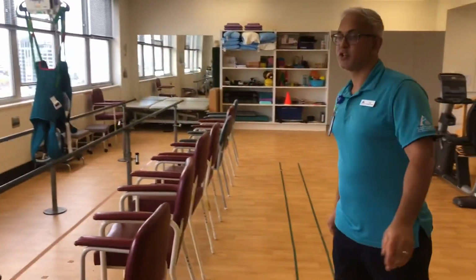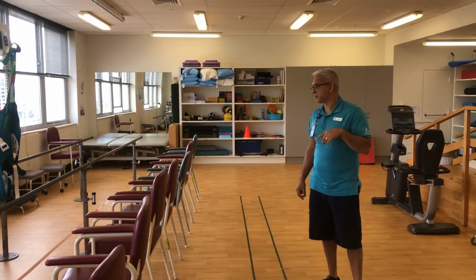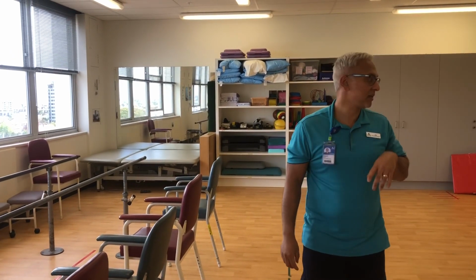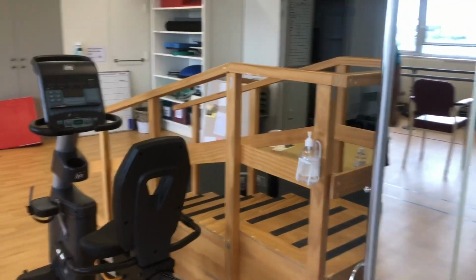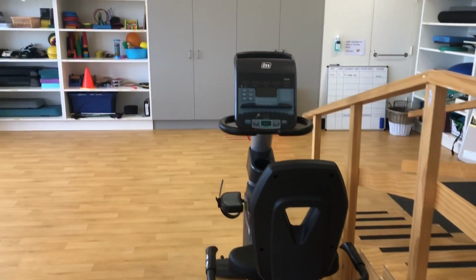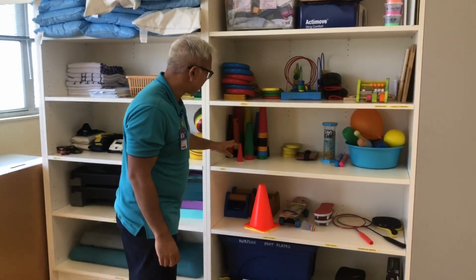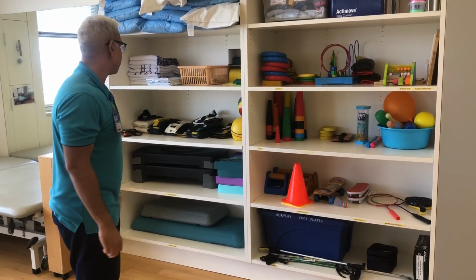This line of chairs is used for when we have group classes, which are also done between the OTs and the PTs. Then the patients are all lined up and use the parallel bars to support themselves when they're doing sit-to-stand training. Other pieces of equipment here, we've got the exercycle, we've got the stairs here that typically the physiotherapists use for when patients have stairs at home that they have to negotiate, and a whole lot of other equipment here that we can utilize for hand therapy, upper limb training, and just functional activities as well, like the easy reach that you can see there.